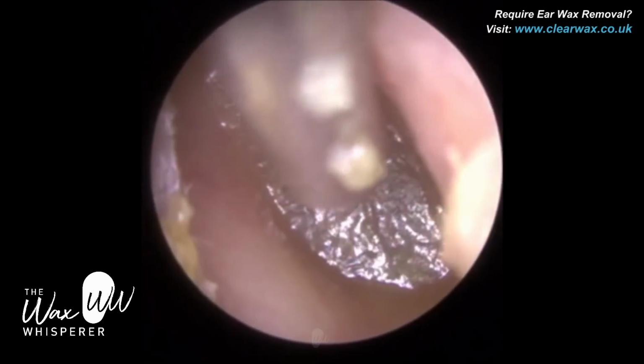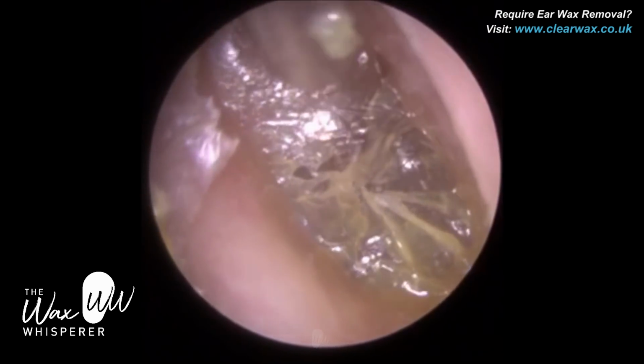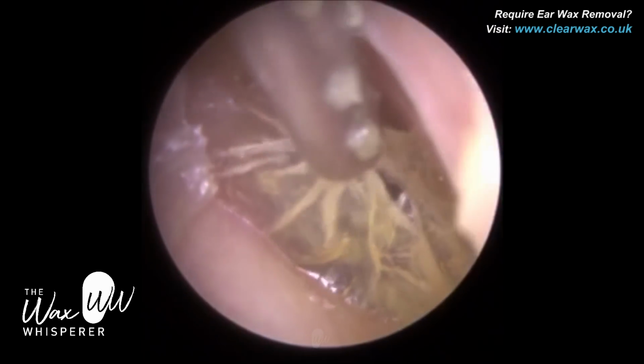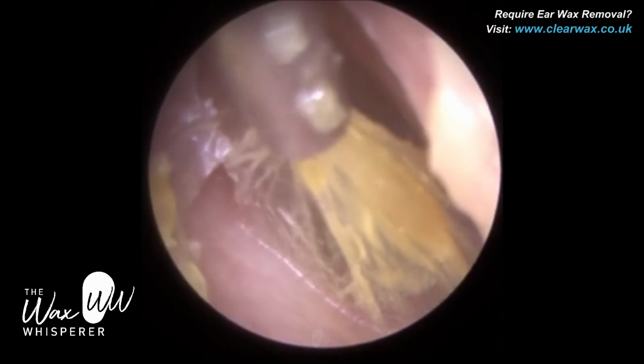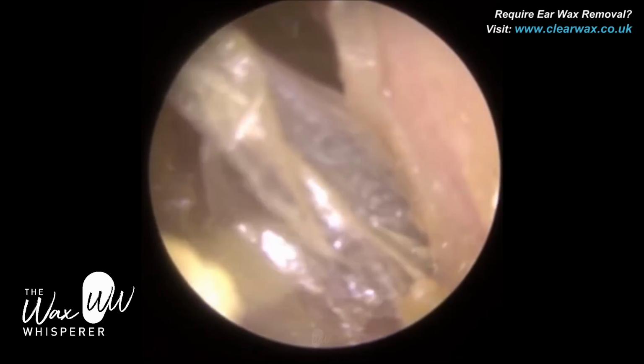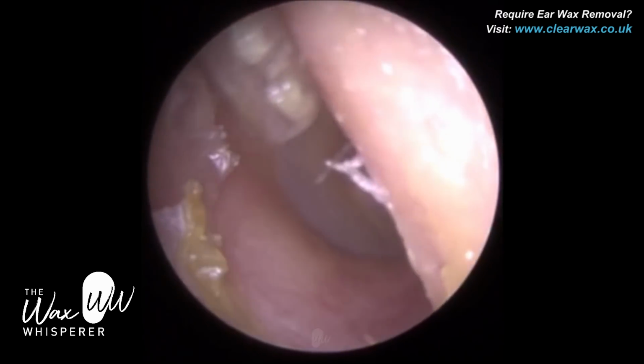The patient here, you can see this keratin, this dead skin that's died, shedded but not migrated. And in the right ear, this dead keratin has actually created a sheet that's completely occluding the ear canal and obstructing the view of the eardrum. You can see we just peeled that off and the eardrum's now visible.